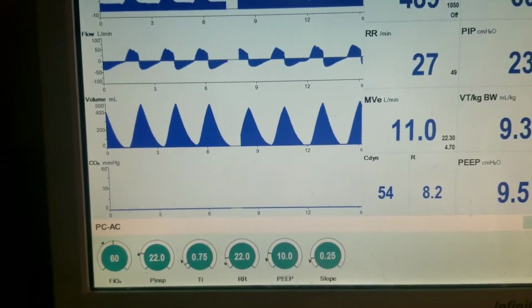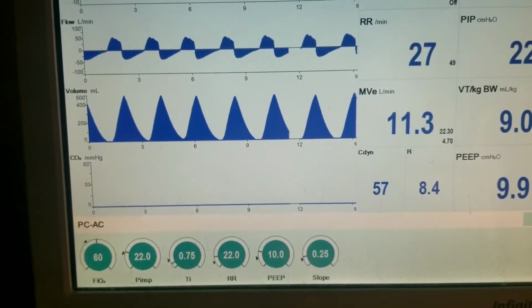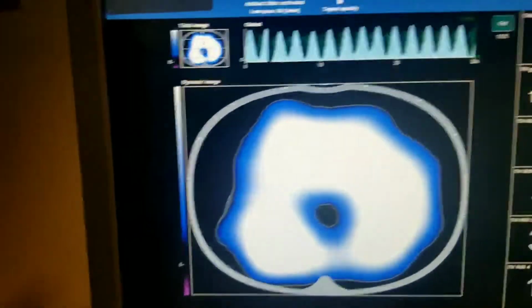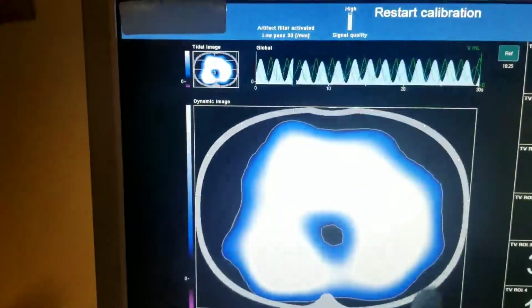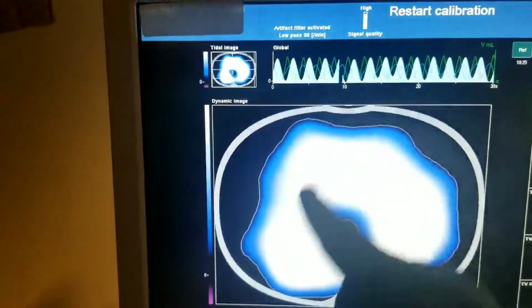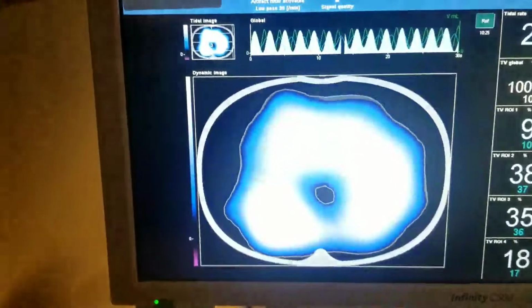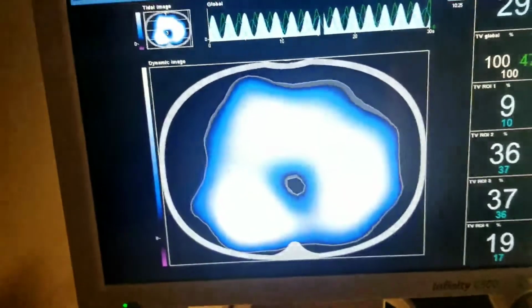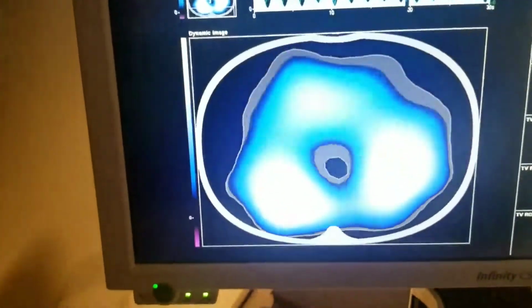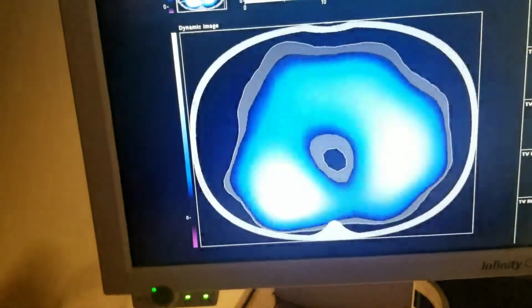All right, we're back down to 10. Let's check the PulmoVista out. This is on a PEEP of 10. I like how the white is very evenly distributed. So this was where we started from. I'll be interested in seeing if 10 is optimal in compliance. It looks so, just with the quick visualization. All right, that's perfect. Perfect distribution. Can't get better than that.